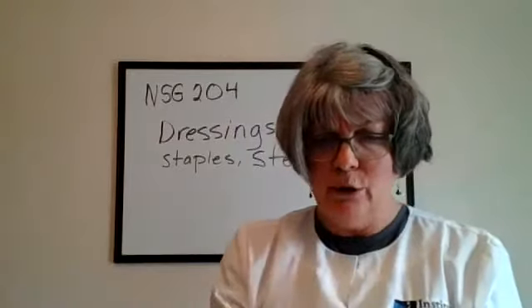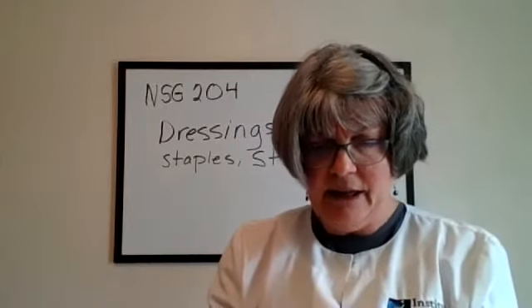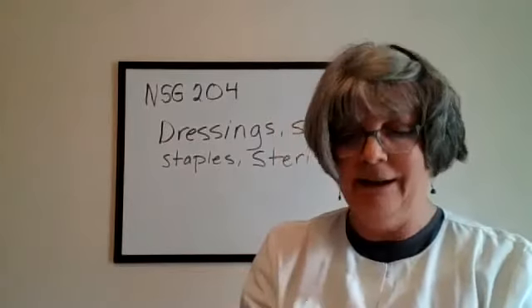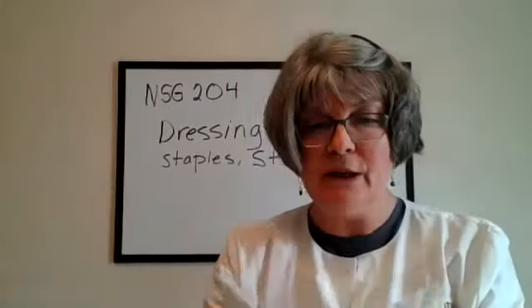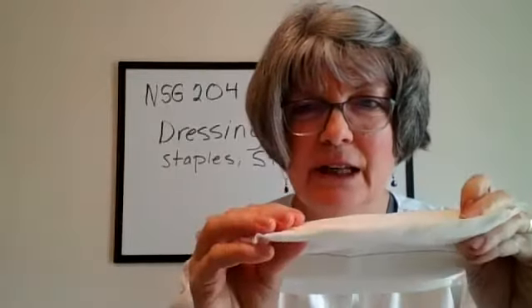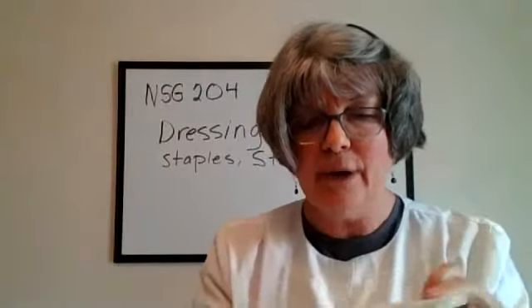If you have a wound that really has a lot of drainage, no doubt you'll use an ABD pad. These are nice, cottony, fluffy dressings. We used this with Jane's Tiny when we did the dressing change. It's a pretty thick dressing.